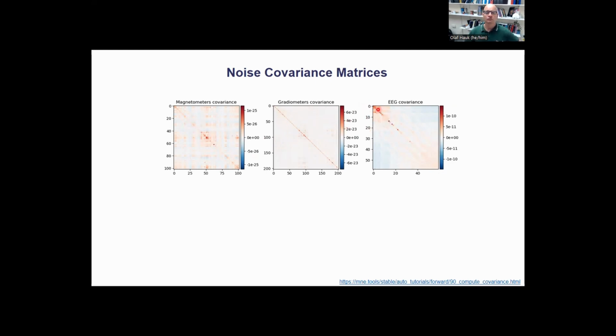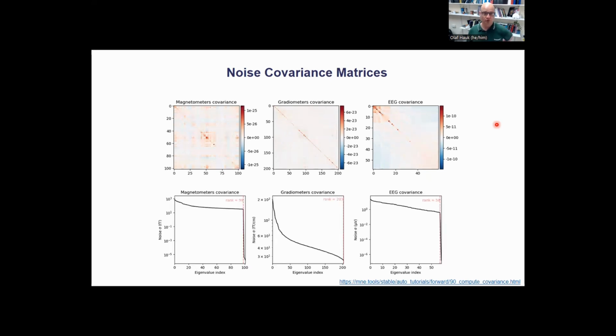That could be due to different reasons. Maybe these are frontal channels and they pick up eye activity or muscle activity, or who knows, maybe there is still an artifact that you should take care of in one way or the other. But if you look at this across your participants, you will probably quickly see what is normal for your data, and then you will potentially find some participants who stick out a little bit. Just another way to explore your data.